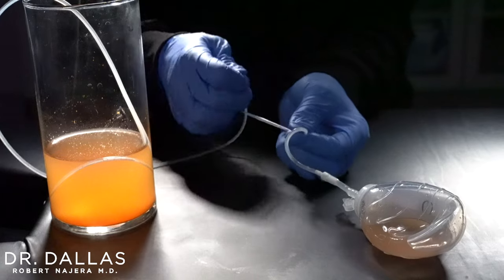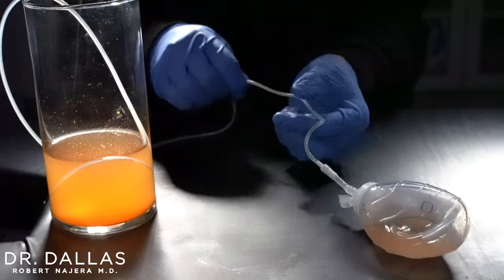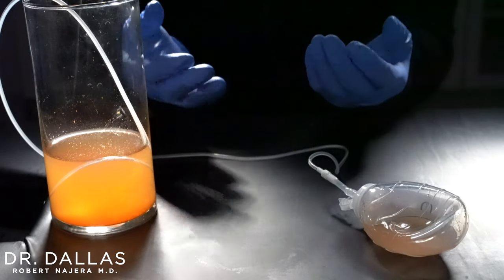Between two fingers you're stripping or pulling the clot into the bulb portion. It's okay if it really stretches — you're not going to pull or break it. Just make sure that you collapse the drain and push whatever's through there towards the bulb.